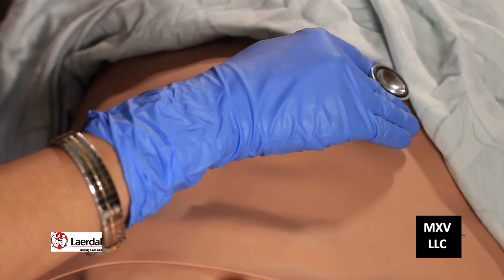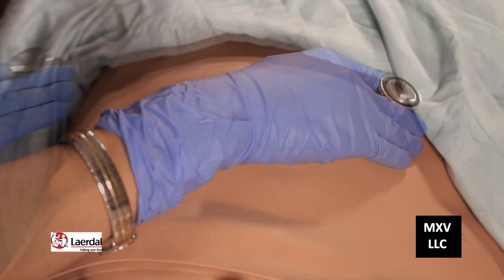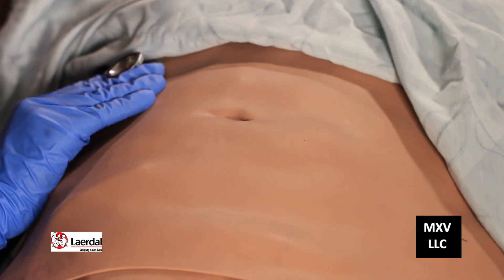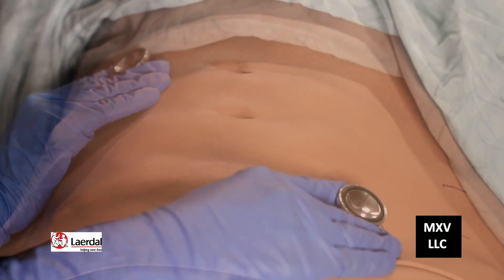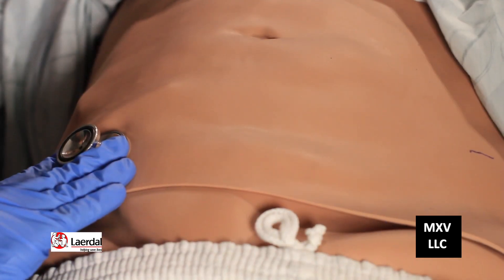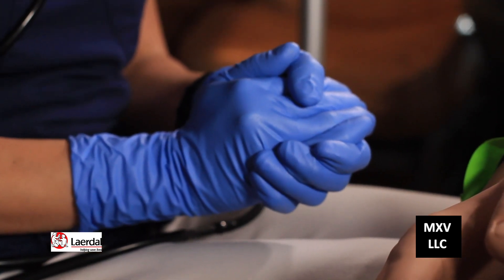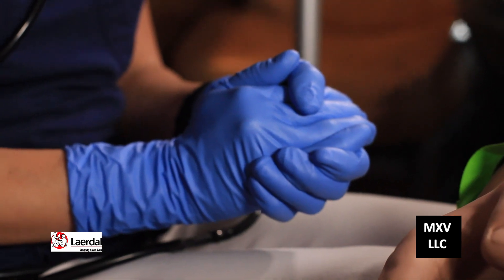In today's assessment procedure, we're going to be listening for bowel sounds. We're going to listen to the four quadrants: the left upper quadrant, the right upper quadrant, left lower quadrant, and the right lower quadrant. We warm the head of the stethoscope by cupping it in our hands, and now we listen to the bowel sounds in all four quadrants.